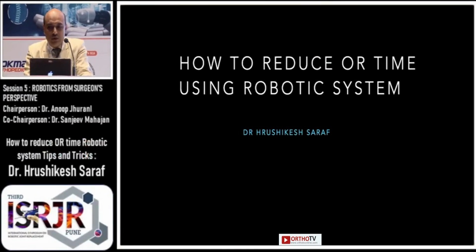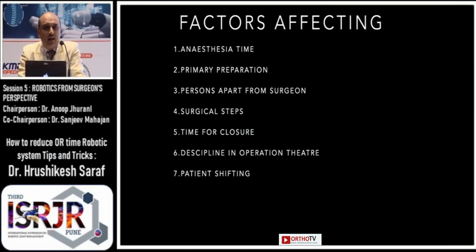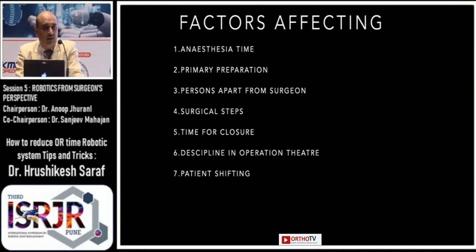So how to reduce OR time using robotic system? There are various factors affecting the timing in operation theatre, starting from the anesthesia time, primary preparation, persons apart from the surgeon, surgical steps, time for the closure, discipline in operation theatre, and patient shifting.